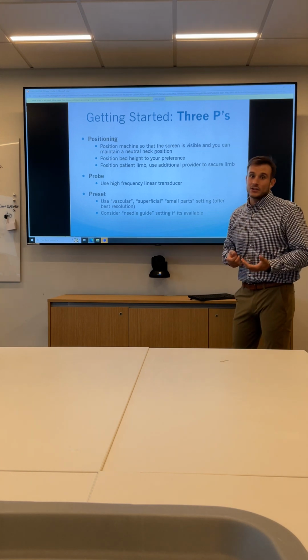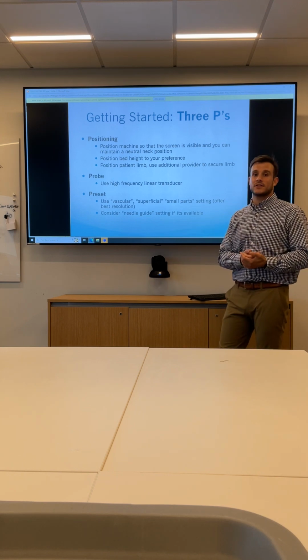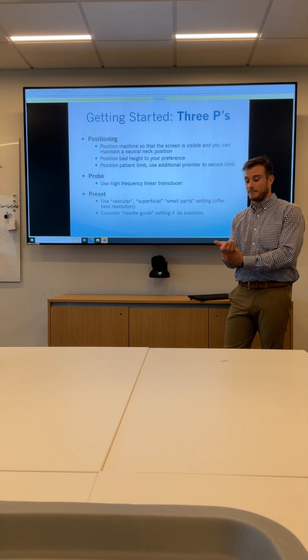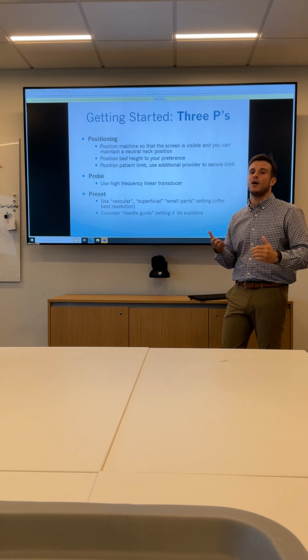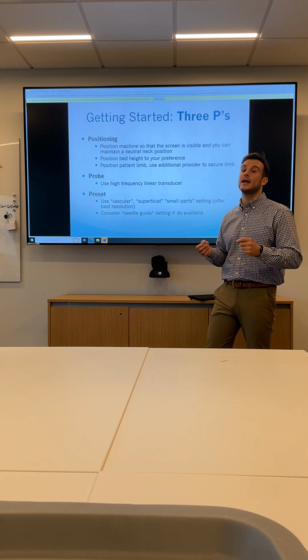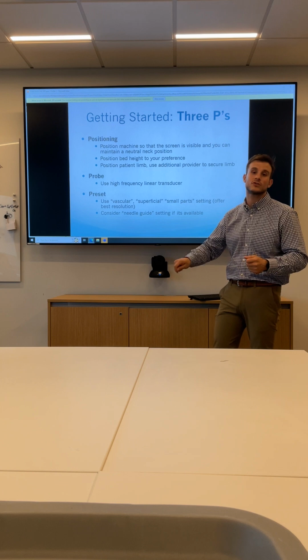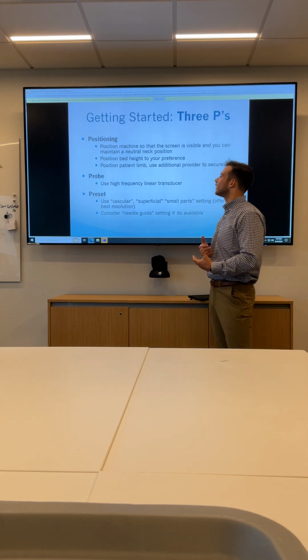And if the patient is not totally with it, or they are anxious and they're restrained, it's okay to ask for help to get someone to hold that limb down. You can also use a restraint to keep them down and some tape to hold that hand in place. It's difficult at first, but it's helpful to talk the patient down if they are getting anxious. Here's what you're going to anticipate: nice sharp pinch, little poke, cold gel, little swab. Walk through what you're doing. It helps to ease the patient's discomfort.